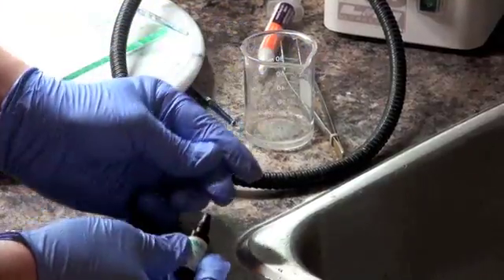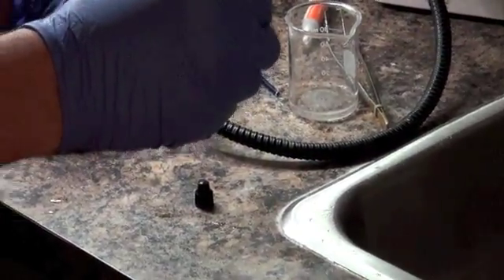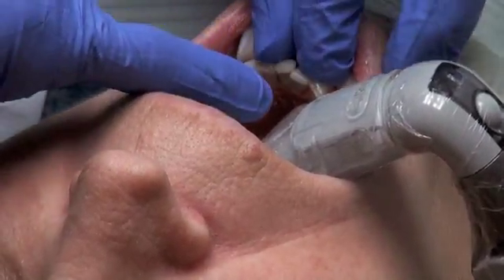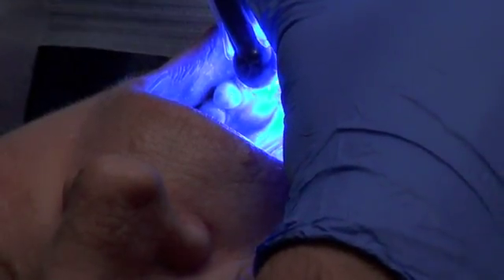Fifteen minutes later, the veneer was removed from the oven and chemically treated to allow a very strong bond or fusion to what remains of the natural tooth using sophisticated tooth-color bonding materials. To ensure a very strong bond, an isolation mechanism is used as the tooth is bonded in place.